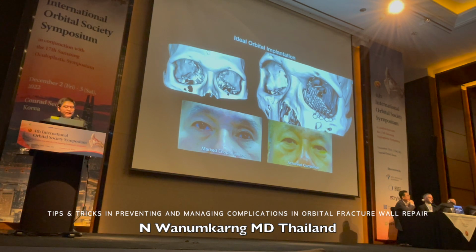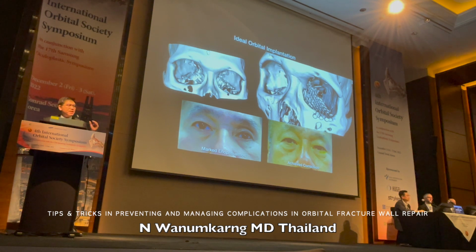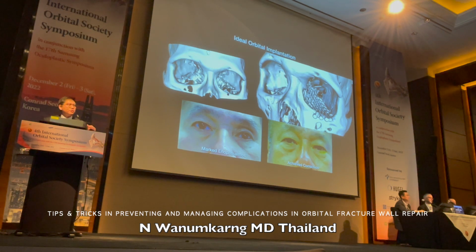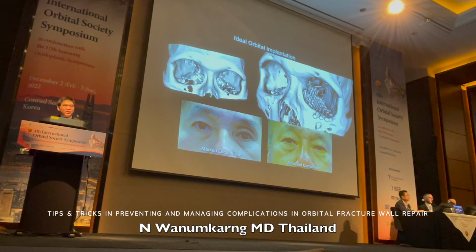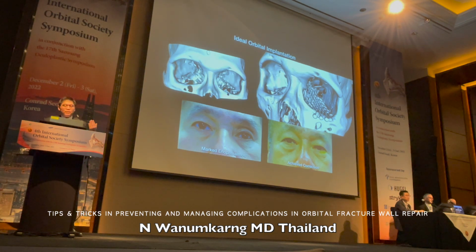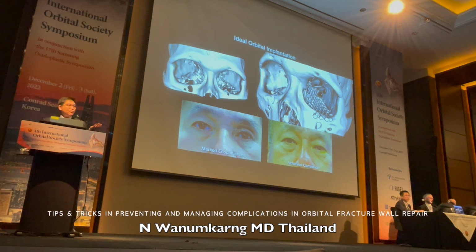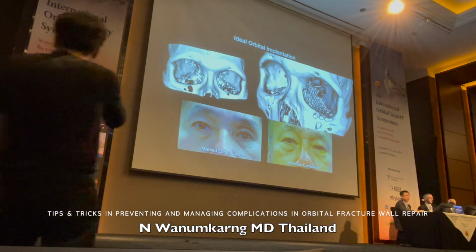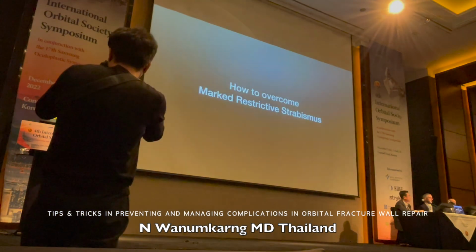If you do that, you will get a very fine, delicate quality of the 3D scan for evaluation. In this case, we do the study the night before the surgery. We learn and become familiar with, and remember, the shape and contour of the normal side. And then we study the affected side. When you do the surgery, remember the contour, because the configuration of the floor is convex a little bit and slightly curves up, and there is a transitional zone between the floor and the medial wall.